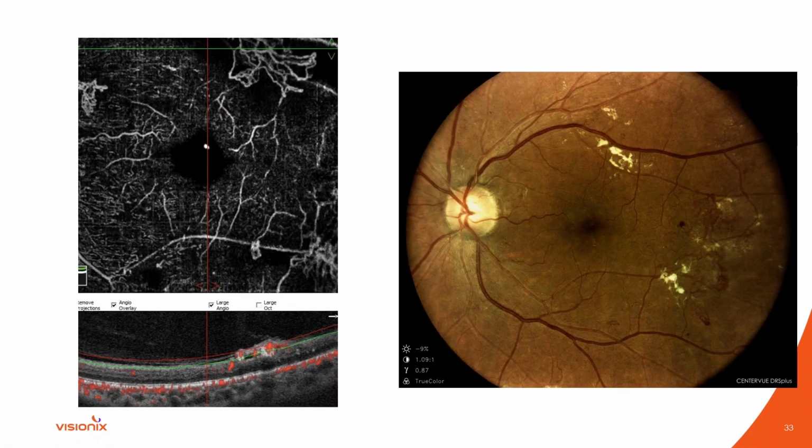The other eye was the quote unquote better looking eye. However, you'll notice that there are also a lot of anomalous areas. You can see over here, there looks to be a lot of anomalous vasculature. And I would say this area here is the highlight of at least what I'm looking at. There's a lot of exudation in the retina as well. But as far as looking for a proliferative response, this is where my attention would be.